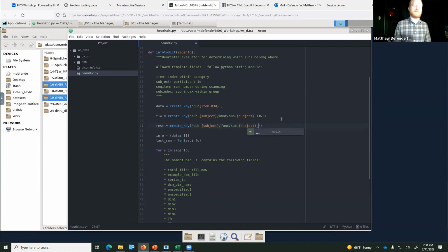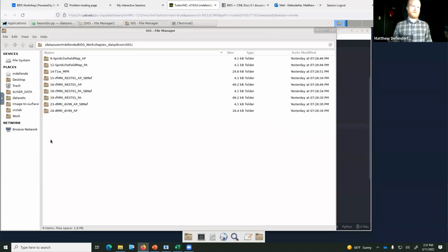You can add a README to all of the subjects saying which folders or which converted scans are good to be used. Or one thing that you could do, think about if you do this.